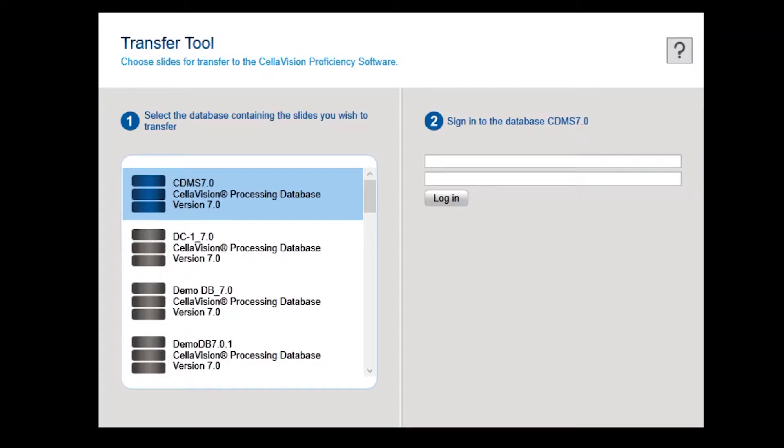Double-click to open the CellVision Transfer tool on the remote review station. If you have problems locating the Transfer tool, use the search function to find it.